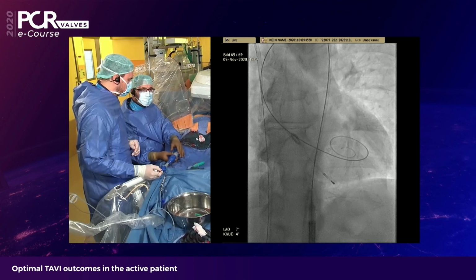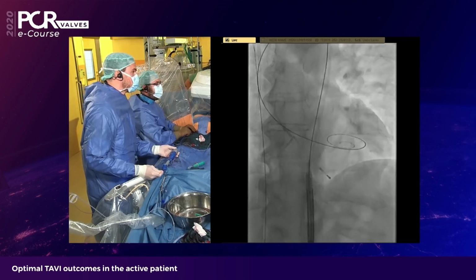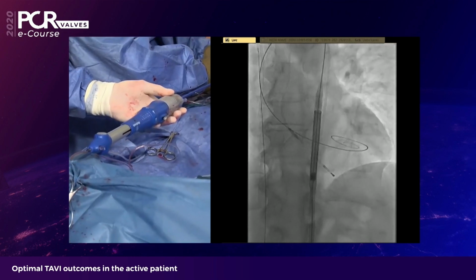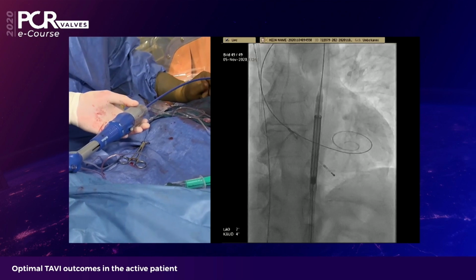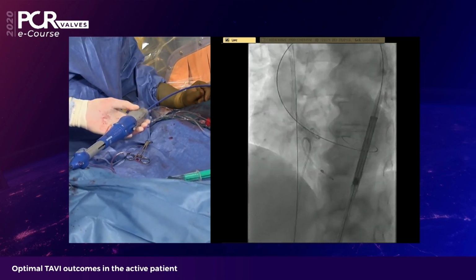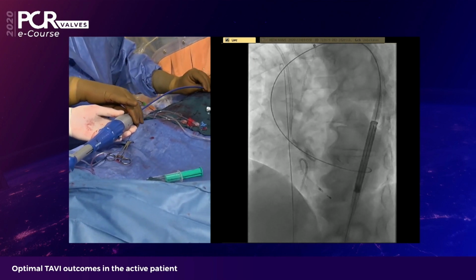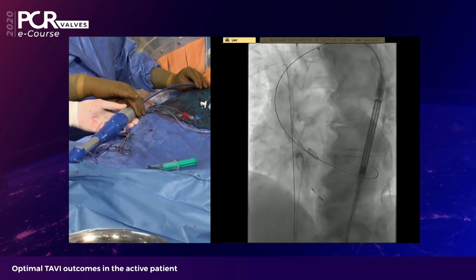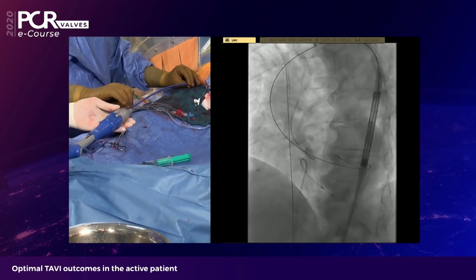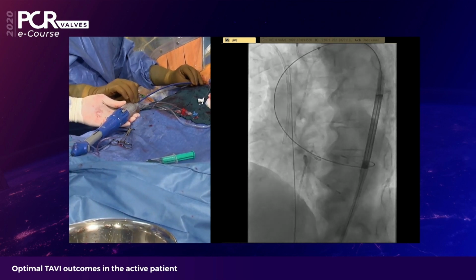If you go at 3 o'clock, then probably, as you can see here on fluoroscopy, in a normal anatomy, if we go a little bit in LAO and open up the curve a little bit, the hat marker will be probably at the outer curve. You cannot see it here quite nicely, but you will see it when we cross the arch. So in this case, the hat marker is, as you can see here now, when we go at 12 o'clock, on the outer curve.